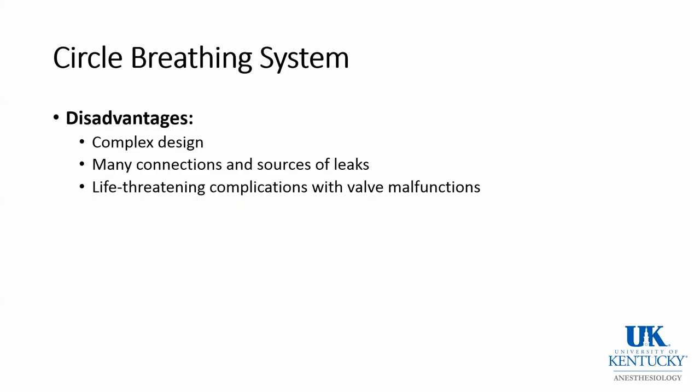Now, the circle breathing system is a complex system, at least compared to open drop ether, etc. There are many connections and sources of leaks. There have been life-threatening complications with valve malfunctions.